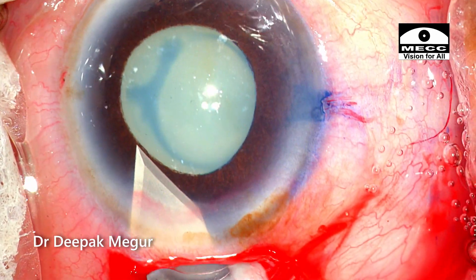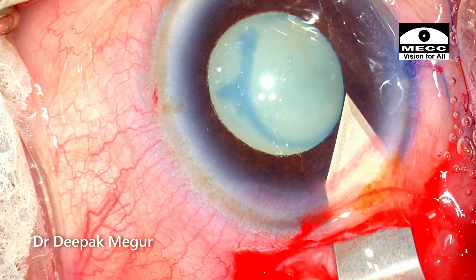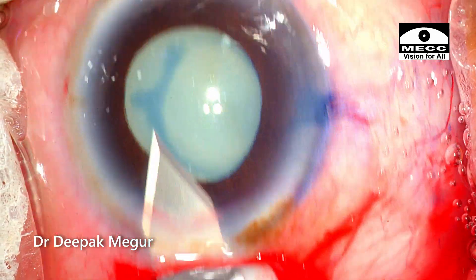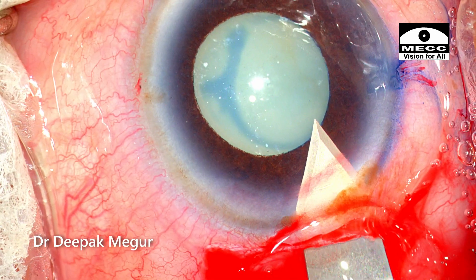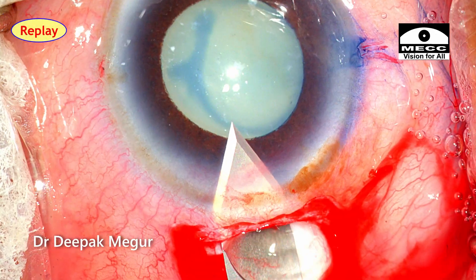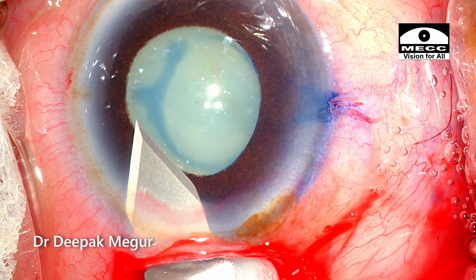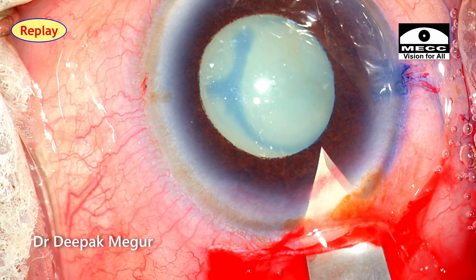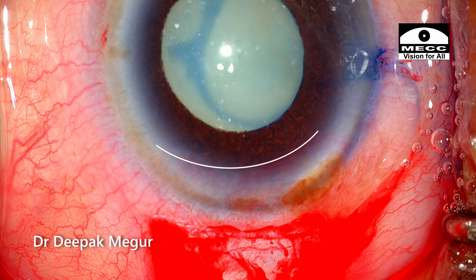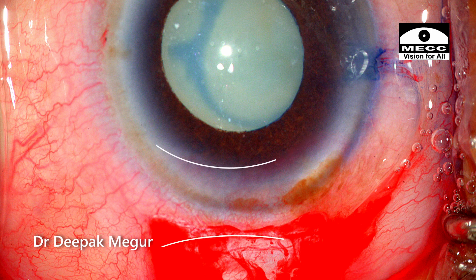A 2.8mm bevel-up sharp keratome is used to enter and then the inner lip is enlarged. Please note that the cutting is done only as I enter, not while coming out — the cutting is done only when going in. As the extension is being done, please also note that the cutting edge is tilted up. This ensures that the inner lip always runs parallel to the limbus. A lot of attention needs to be given to the way we construct the scleral-corneal tunnels, and the sad part is the internal incision is always ignored.